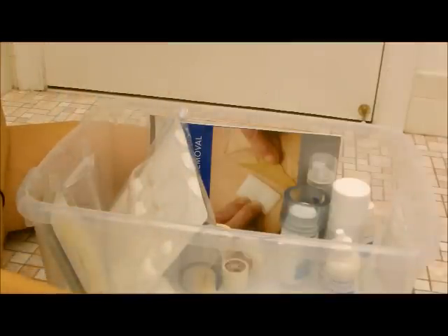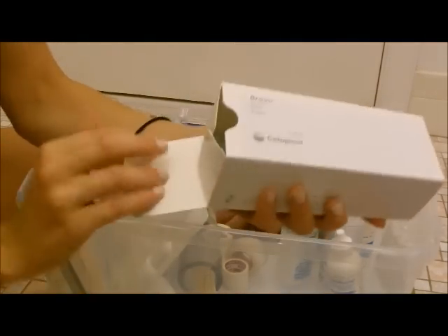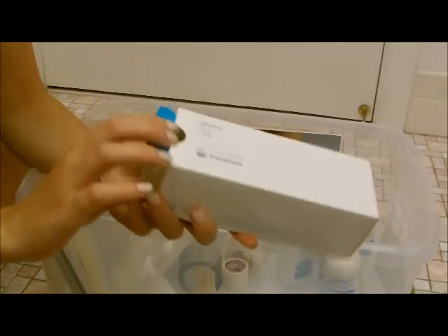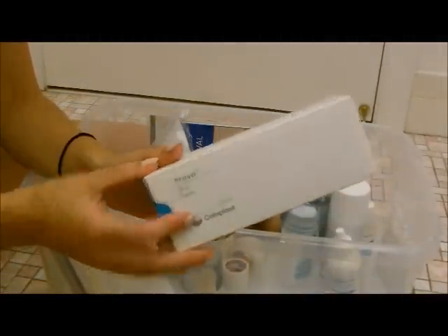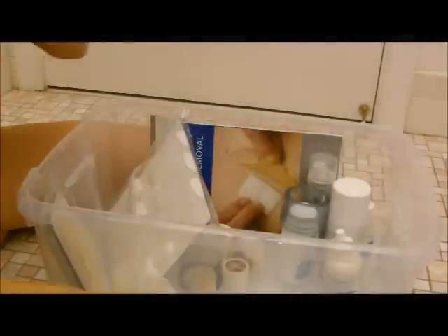Other things I have in here are my Brava strip paste. This is by Coloplast. I'll take it out and show it to you. I've shown this in many videos before. I just take a little piece and make a ring with it and put it around my stoma, but I'm trying not to use this as much. I want to try other products out there because I want a better bag sticking to me, and I also want to provide good products to you guys so you know what's going on.